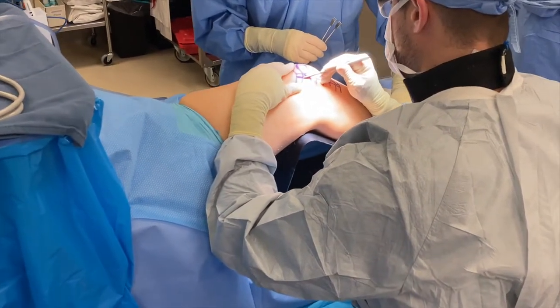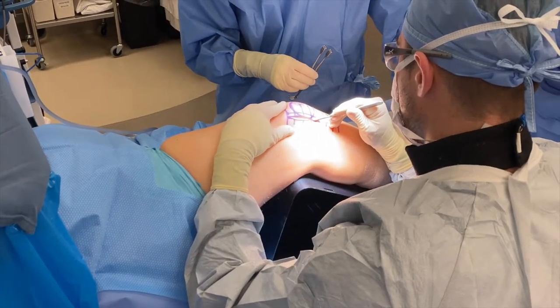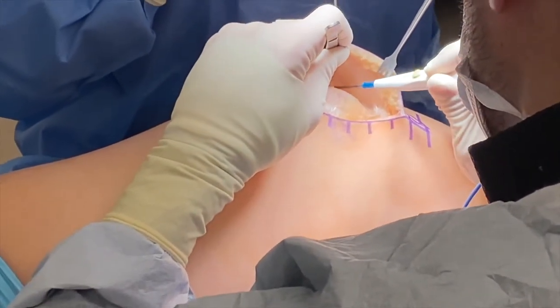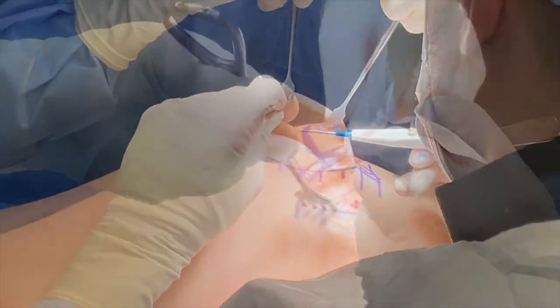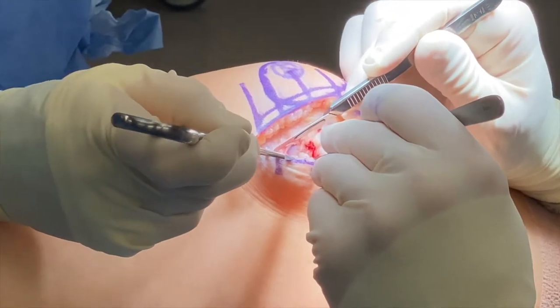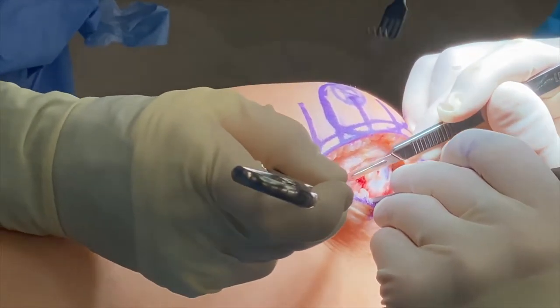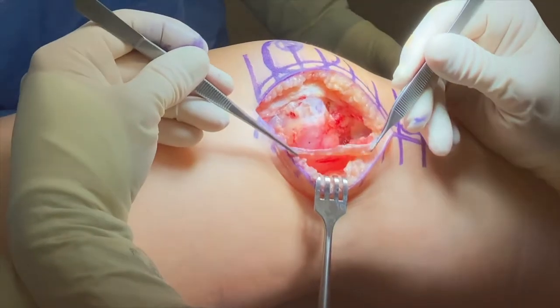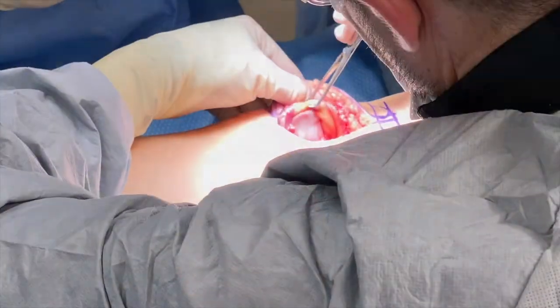This is us making an initial incision over the lateral side of her knee. We begin by dividing this lateral retinacular tissue into two layers, which will allow us to lengthen these tissues at the end of the surgery to help rebalance the patella. Here we see the superficial and deep layers of the lateral retinaculum that we've now created.